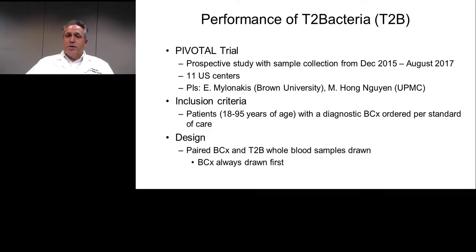These are patients in whom a diagnostic blood culture was ordered per standard of care, and a design in which the blood culture was simultaneously collected along with the whole blood sample for T2 testing.